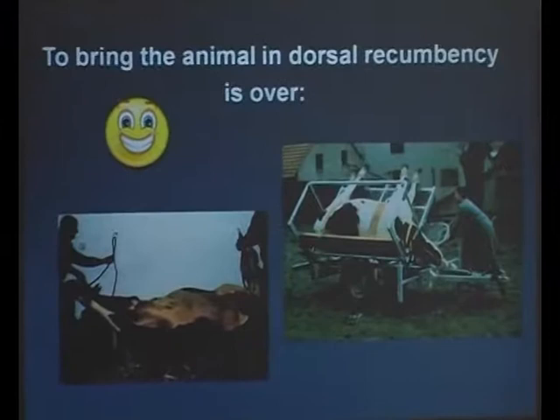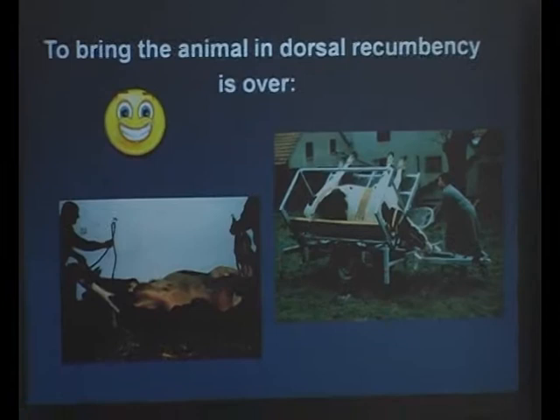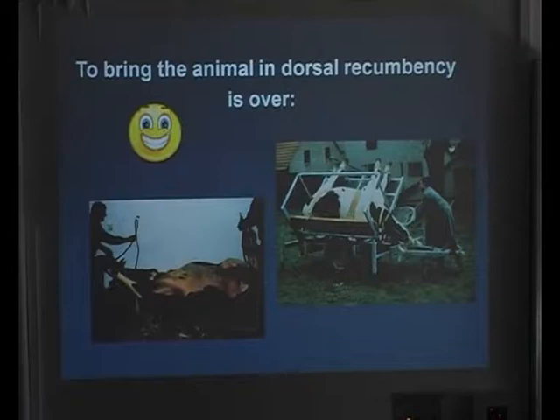And I think it's a small country. As soon as one practice in an area starts doing laparoscopy, and the neighbors hear about the laparoscopy, the neighbors also tend to start on laparoscopy. So for Heinz Janowitz, a lot of cows are brought in from 50 to 80 kilometers to his practice, but this is not in the Netherlands. So we have to operate on the farm, and as you can see, and the video was super, I think, it is hard work. You need more labor to bring the cows to recumbency.